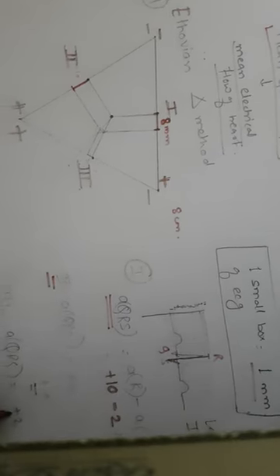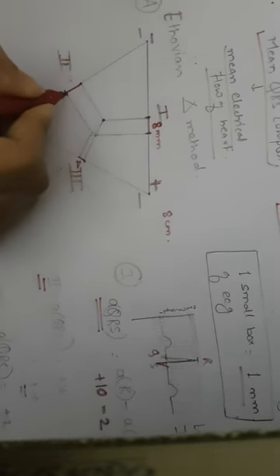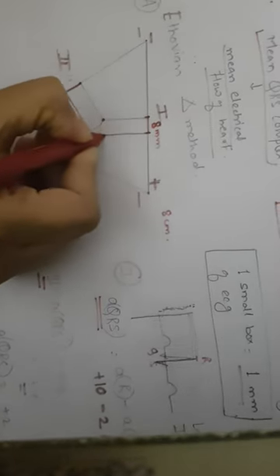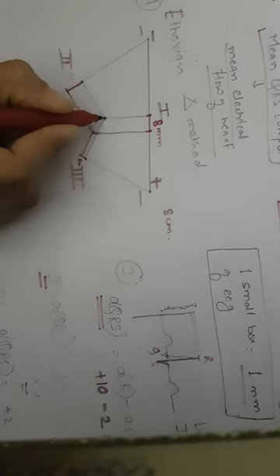Same way for lead 3, the amplitude is plus 2. So towards the positive side you will mark 2 mm. Now you have to draw a perpendicular line from your markings. Okay, so this is the point where they meet. From the center of the equilateral triangle to that point you have to draw an arrow.